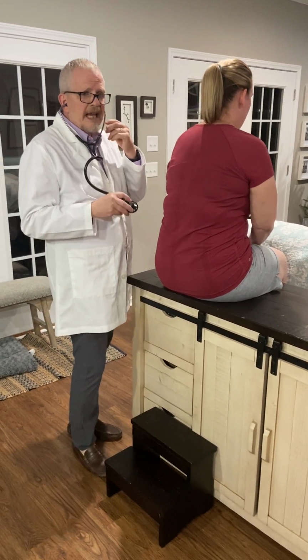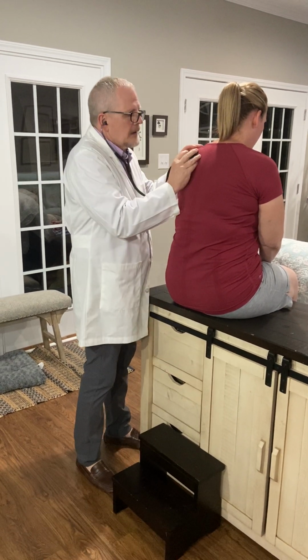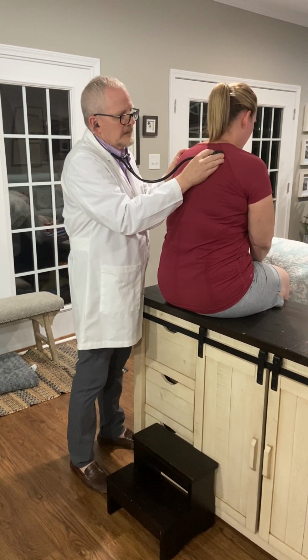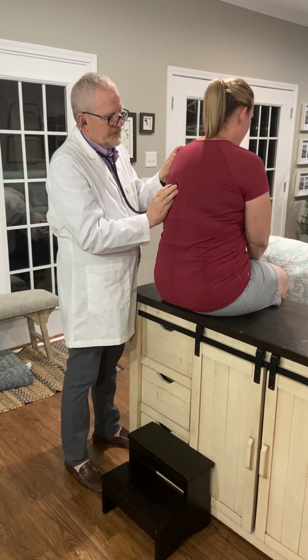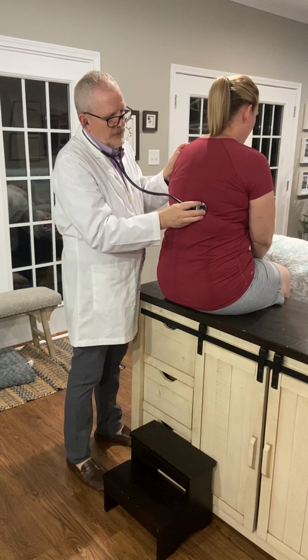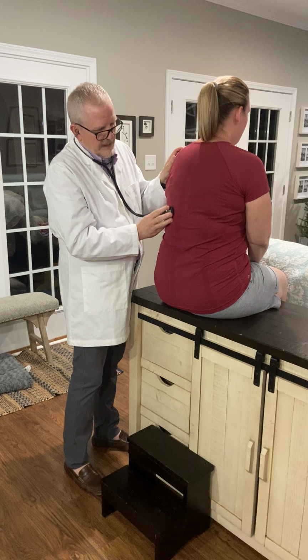Now I'm going to listen to her lungs, and there's going to be 7 areas using the ladder step method going down. Now I'm going to assess. That's 1. This is 2. This is 3. This is 4. This is 5.